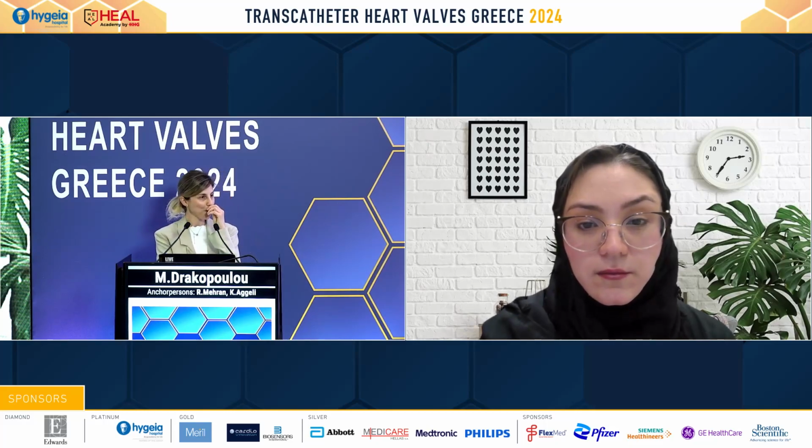Thank you very much for the presentation. Even if the tricuspid valve is anterior, and as you know, the transesophageal is very difficult to image, you had very good images for the transesophageal cases.